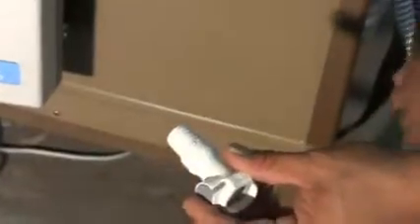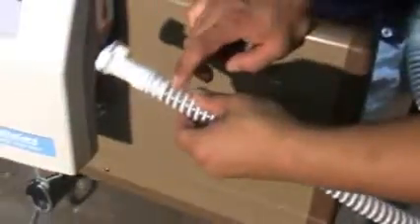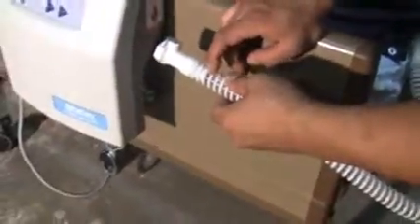Once you have removed all excess tubing from your tube connector, as such, you may take your tube connector to your air tube and twist and push firmly until your tube connector is firmly inserted into the rest of your air tube. That would repair any air holes that would be in your air tube caused by the air unit overheating.